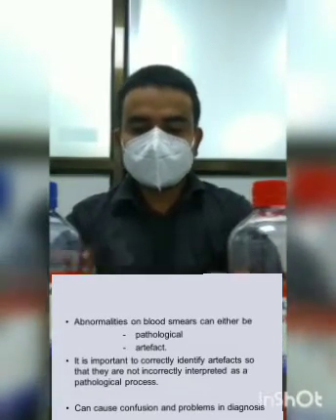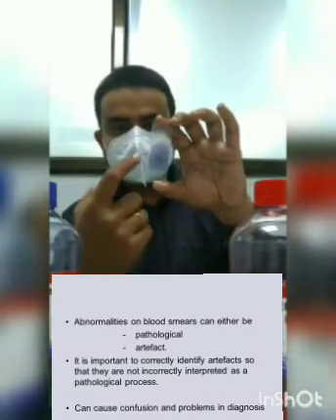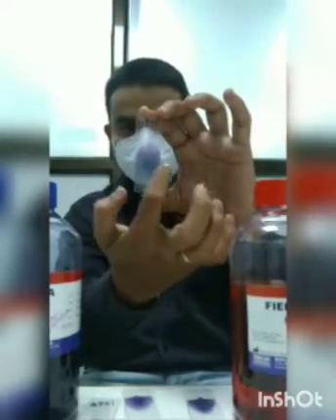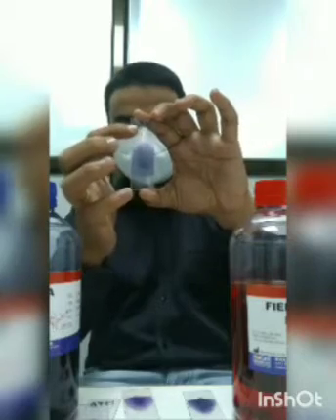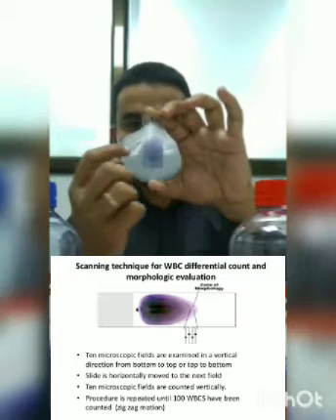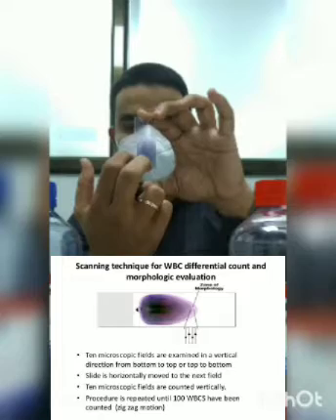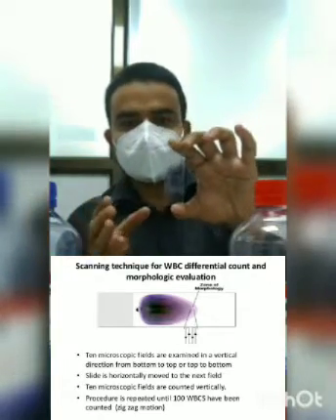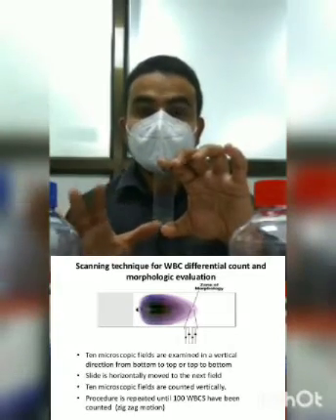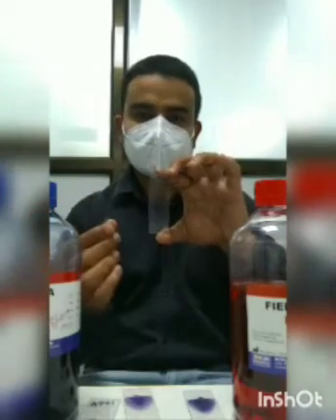If you see this smear, it is a very thin smear, and you may see some serrations at the tail end of the smear. This is the tail end of the smear, this is the head. So what is our viewing area? The viewing area is just here, near the tail end, where the RBCs are touching each other and more than 50% of RBCs are not overlapping each other. Here we can comment upon the morphology of the red cells.